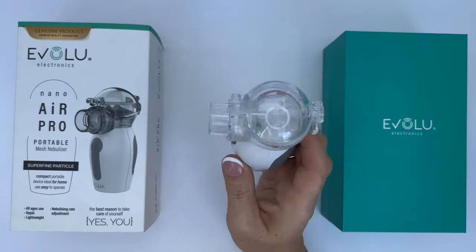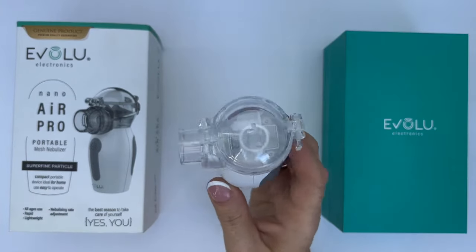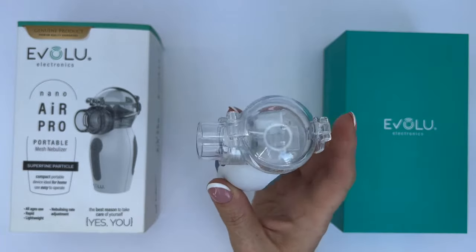Before the first use, when medicine is in the cup, it is necessary to moisten the disc by shaking the device slightly.